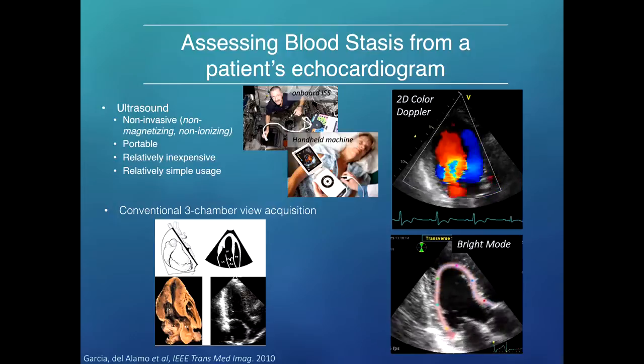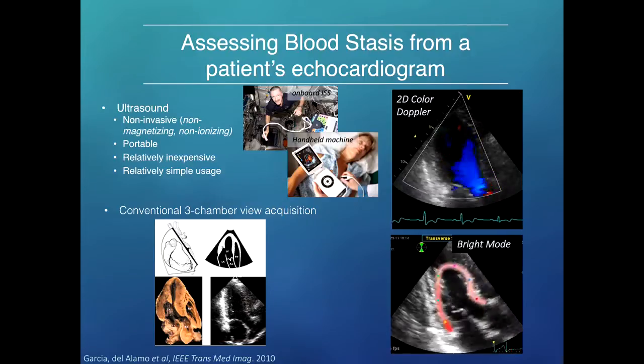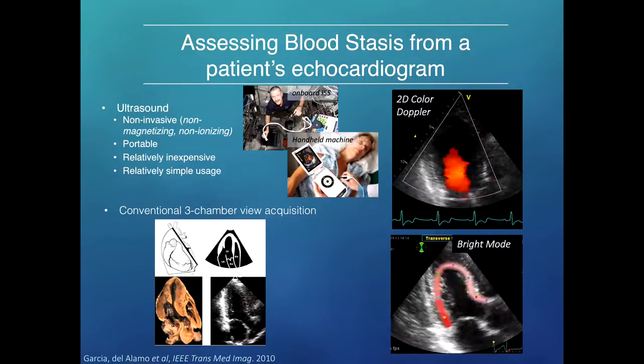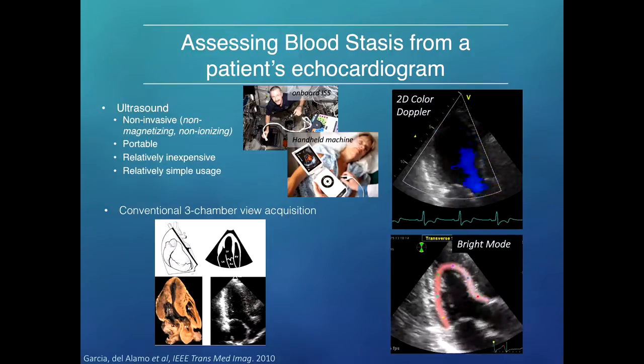What you see here is what is called a color Doppler echocardiography. The color there is indicating the speed at which blood is flowing towards the transducer in red or away from the transducer in blue. So it's telling you the flow speed of blood in the direction towards this point or away from that point. However, blood flow inside the heart is obviously not only in one direction; it's multi-dimensional, and knowing the flow speed only in this direction doesn't tell us everything about the complex swirling flow patterns that we just saw a minute ago.